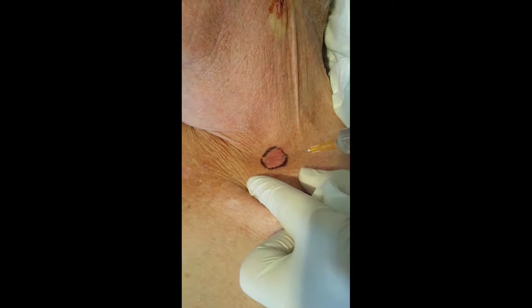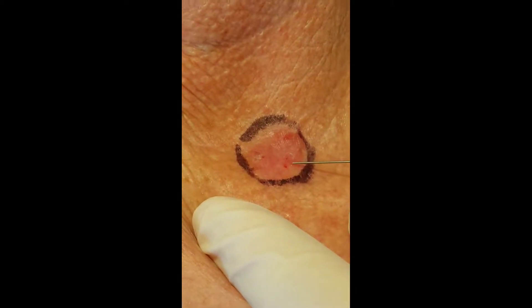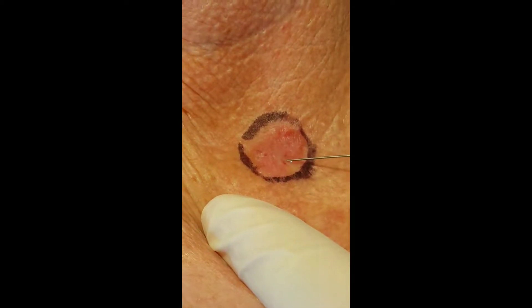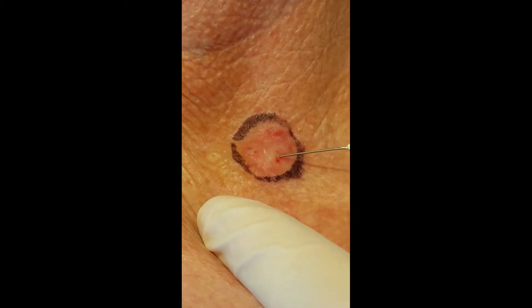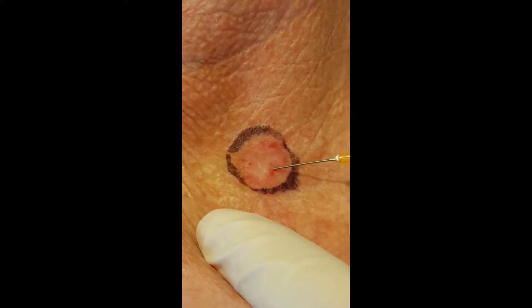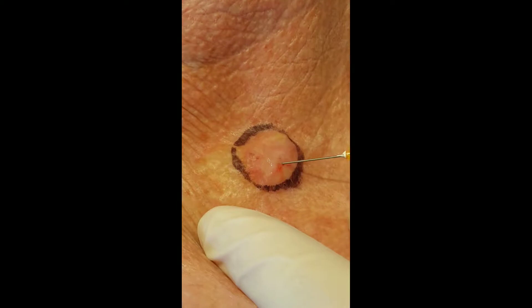We now infiltrate a small area with local anesthetic. The needle is inserted just under the skin and a bleb is raised. Injecting anesthetic like this is painful; however, you'll get dense rapid anesthesia. The anesthetic is injected quite slowly to try and reduce the pain.